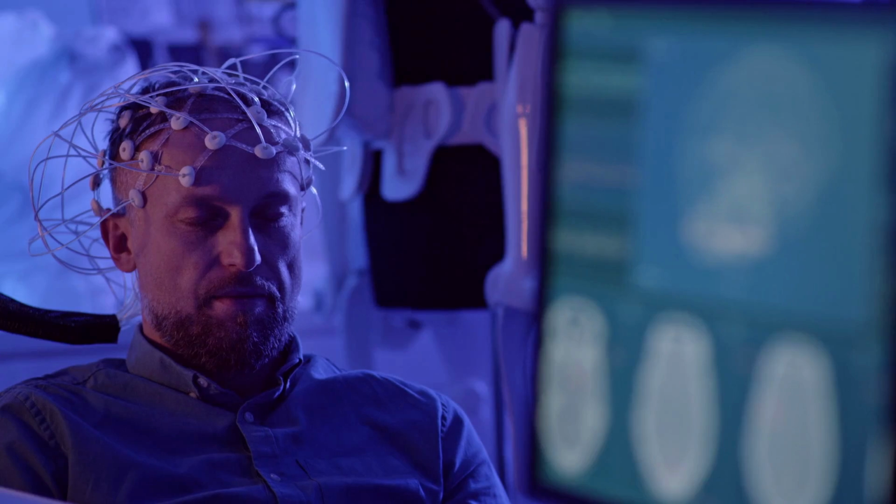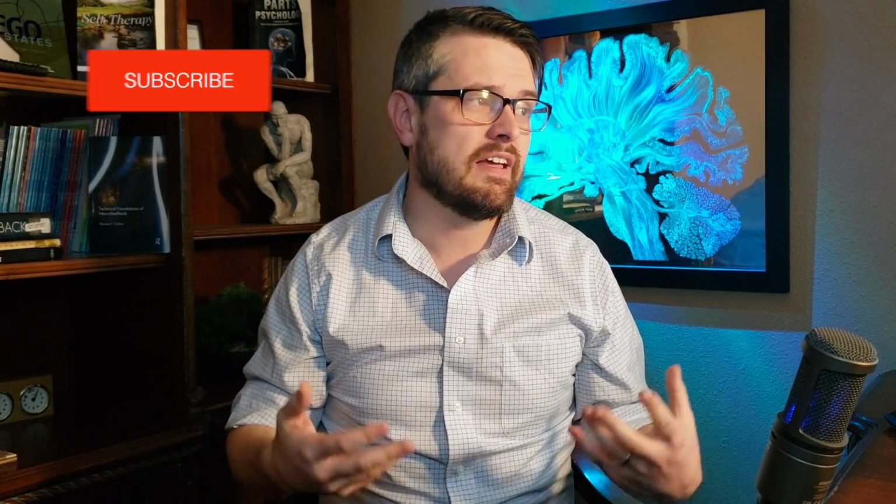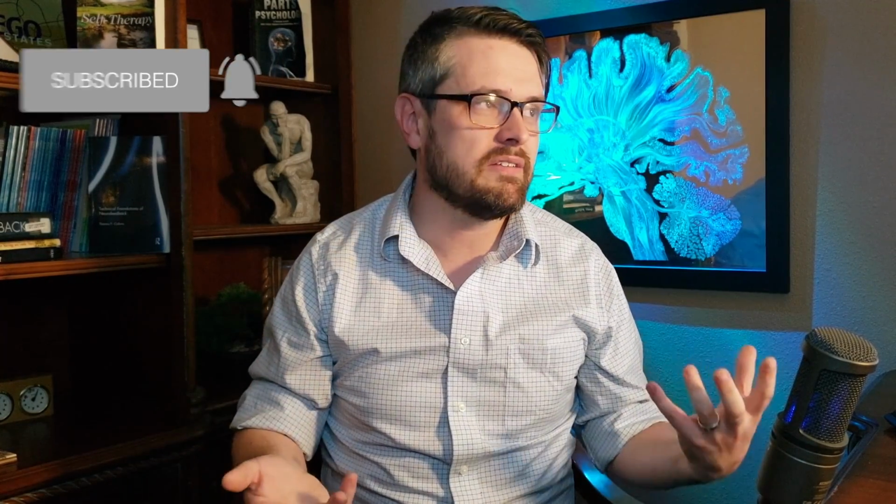So you sit there and you're still, and you have your eyes open 5 minutes, and they say they're done. Then you do one with your eyes closed for 5 minutes, and they say they're done. They take that, they send it into a database, and for you, at that point, they say, thank you for coming. You've got a bunch of gel in your hair, and you're like, wait, I just came in and you just took 5 minutes, eyes open, eyes closed, and that's it. Maybe you took 30 minutes to actually get set up. Yeah, that's basically it. It's then sent into a database.